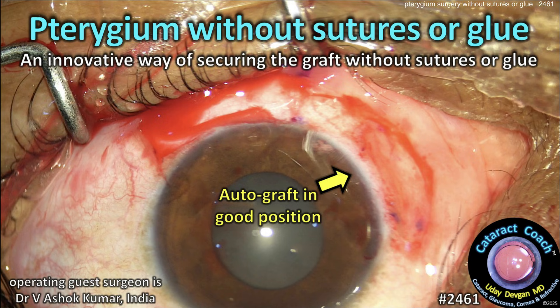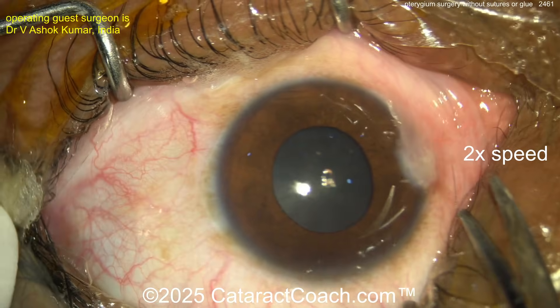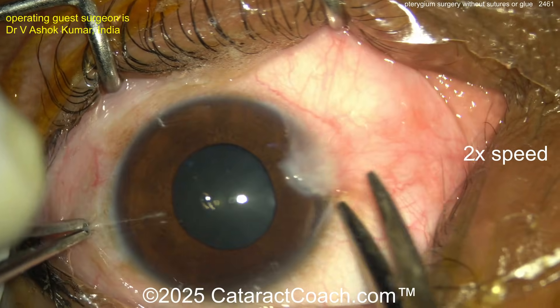cataractcoach.com — pterygium without sutures or glue: an innovative way of securing the graft without using sutures or glue. So there's the pterygium — not too bad. We've sped the video up so we can get through it efficiently.